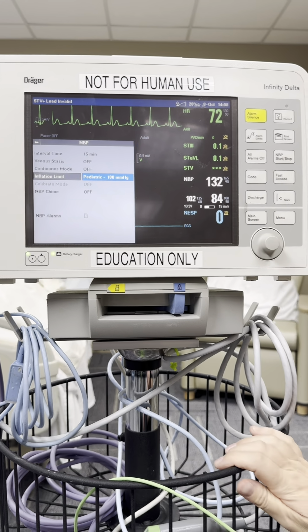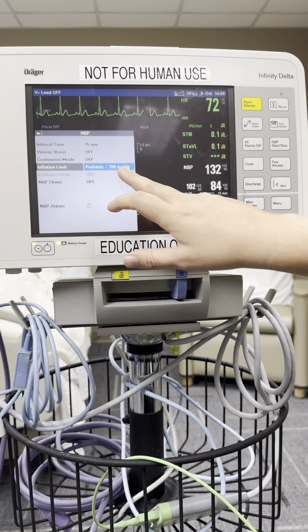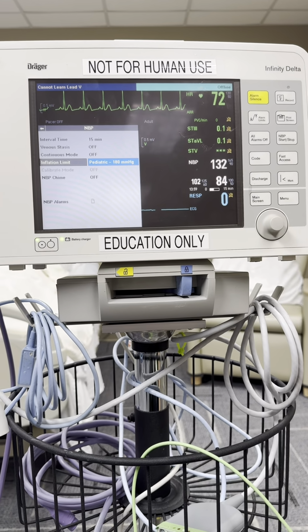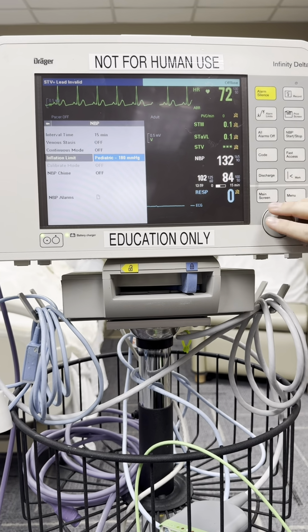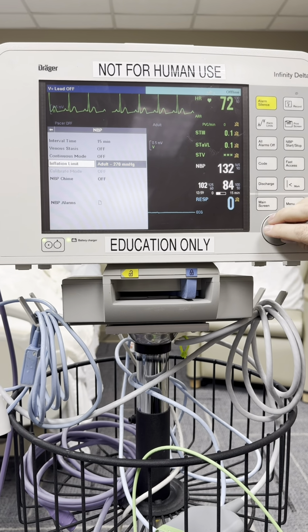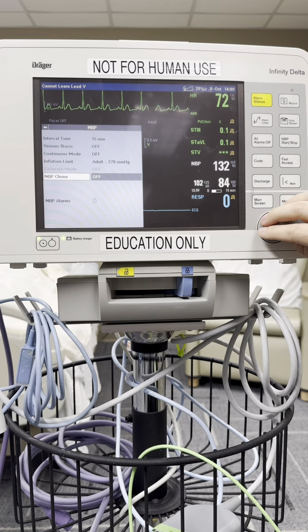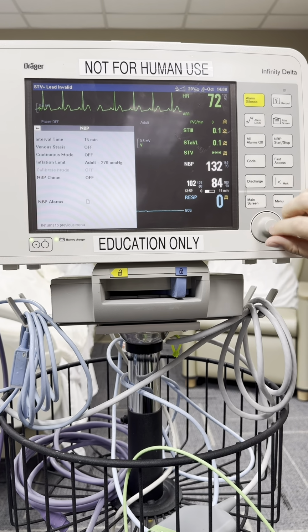So if you've got a little old lady that has lower pressures and you want to change it, you can do it from there. But again, it's not recommended because if their systolic is over 180, it will not catch that. Flip it back to adult. There's a chime, and then your alarms you can change from here as well.